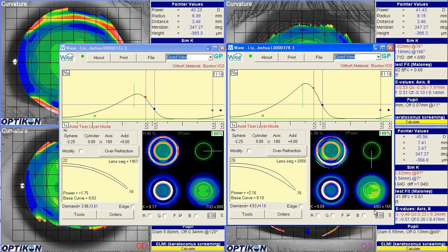Plus, with only about 3/4 of the diopter of corneal fill, there's not that much holding the lens in place. So prism ballast, I think, is a good idea for this lens to make sure we are in line with what our expectations are. We also increase the sagittal depth of the lens a little bit, since we were a little bit loose in the periphery.